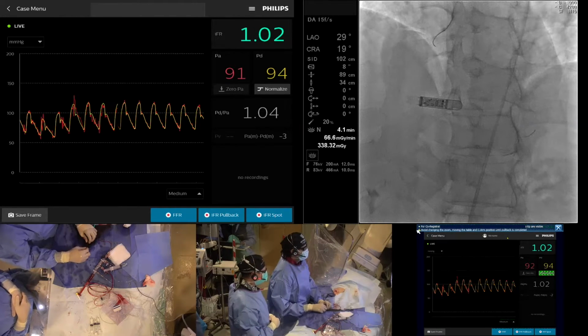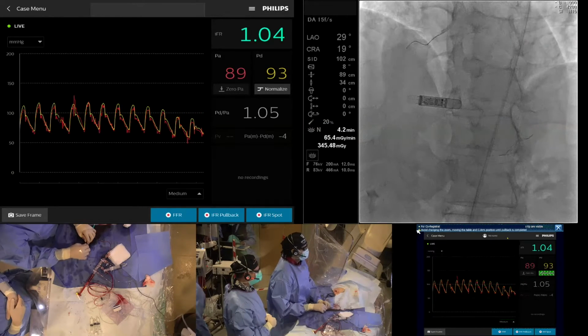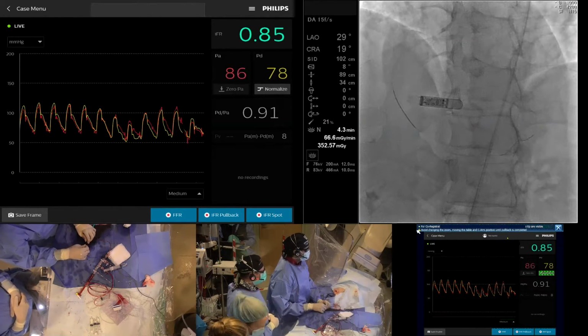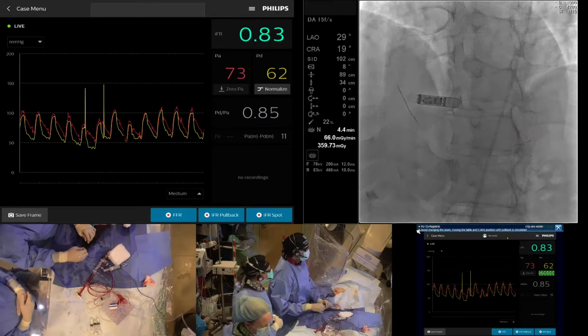Yeah. Well, I think that branch has a lot of diffuse disease. What I think I'll do is we'll advance this and then maybe we'll go ahead and disengage it. Oh, wow. What do you think? Oh, man. Look at the torque. Even you can do it, huh? Look at the movement of the wire. Yeah, I know. Is this the other branch or no? I had the other branch. Sure. Try the other branch.